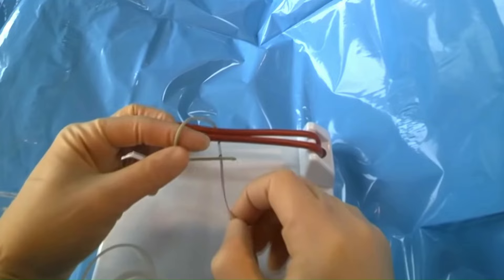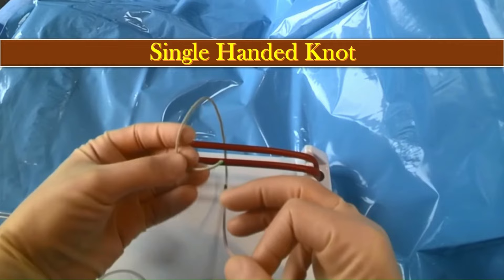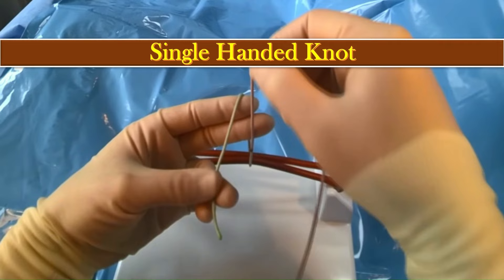Today we will learn the techniques of applying different types of surgical knots. First comes the single-handed knot. In order to apply this type of knot, we will pick up the short thread which is currently facing up, placing it between the thumb and the ring finger, laying it downward over these two fingers.